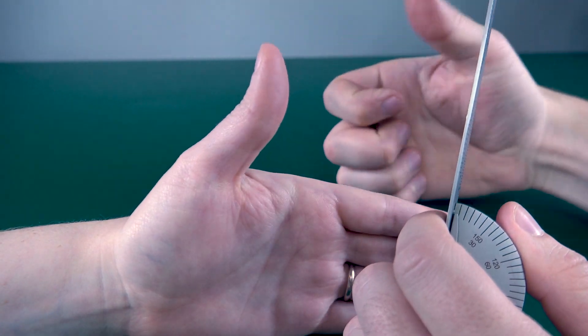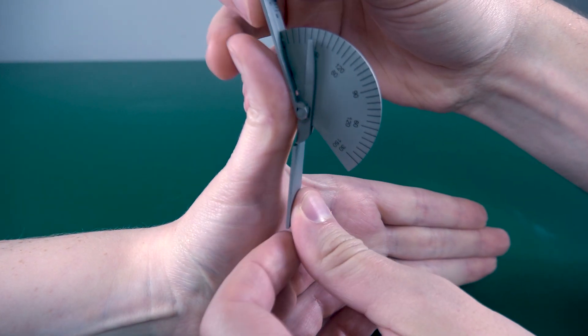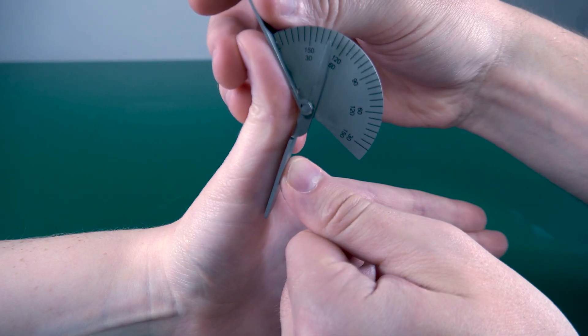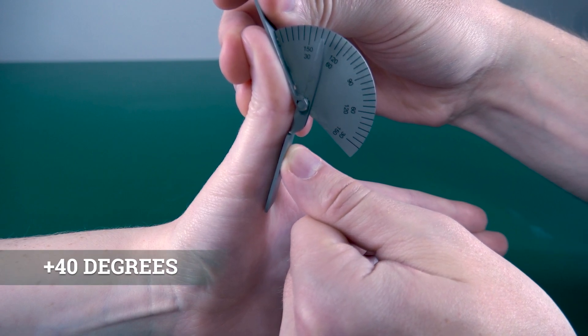So Rachel, if you could hyperextend that thumb backwards as far as you can go — there we go. So we're looking at 40 degrees of hyperextension.